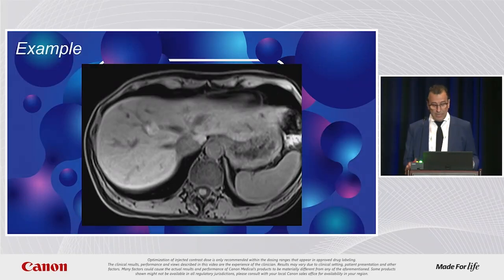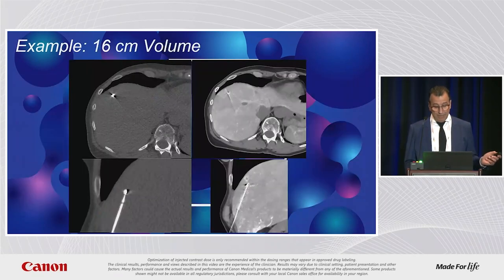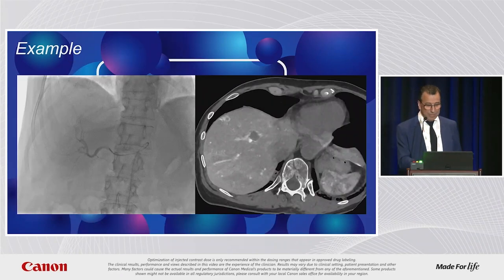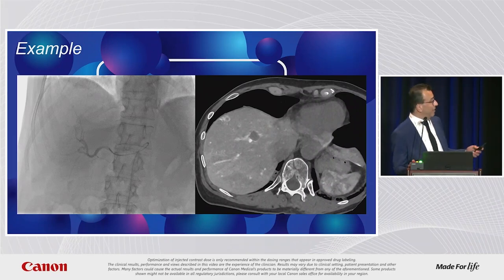You have a liver case like this. On MR, you see the Mets, to see exactly where you want to go. I think what I see here is not what I see there. It's okay, I will show you like this. Anyway, you see with 15 mils of contrast, you see exactly where the Mets is. 15 mils, 0.3 second acquisition, you see your Mets.